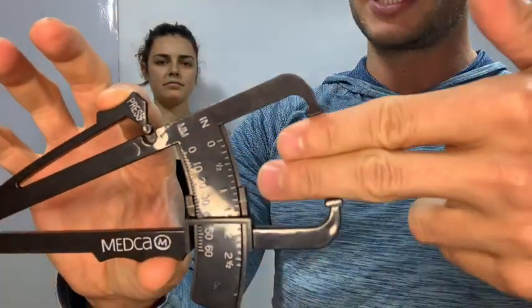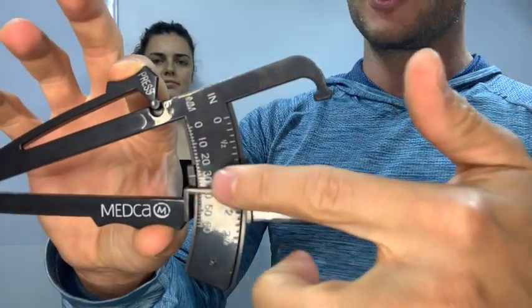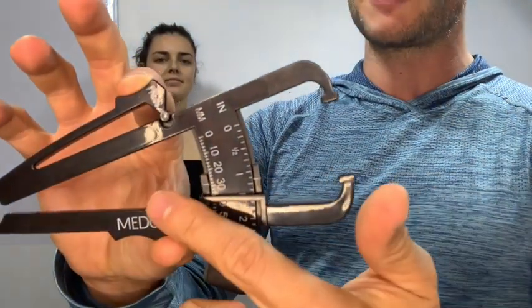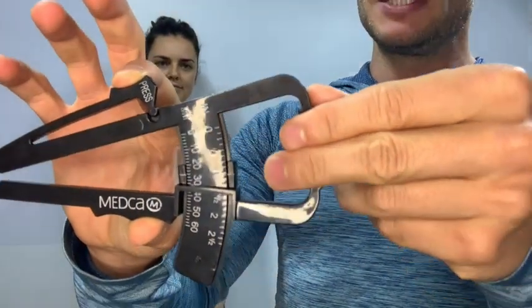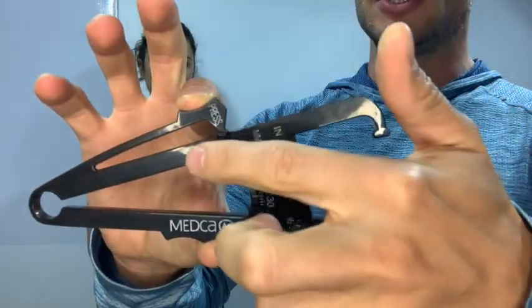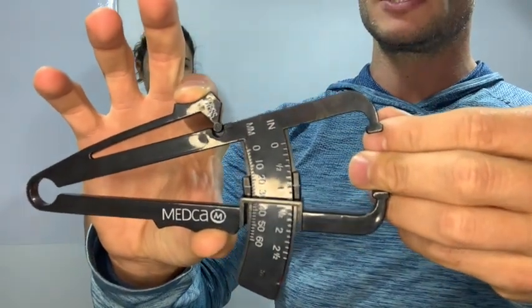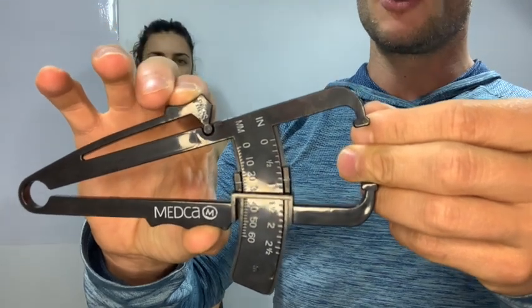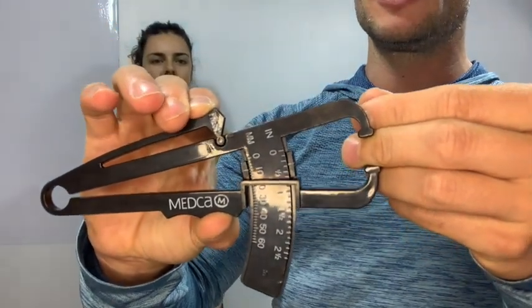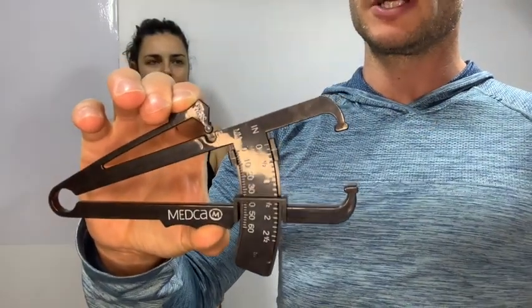So I'm essentially going to have the Skinfold here. As I squeeze, it's going to move the indicator for me. Yours might be attached to the arm, doesn't matter. So again, I'm going to squeeze, and I'm going to actually watch this closest. So just as you get to the point where it just clicks into that slot, that's where you want to stop, okay? So if you over squeeze a little too hard, you notice that I pressed that indicator quite a bit farther than I wanted to, okay?